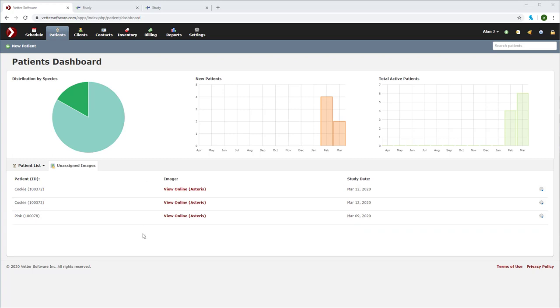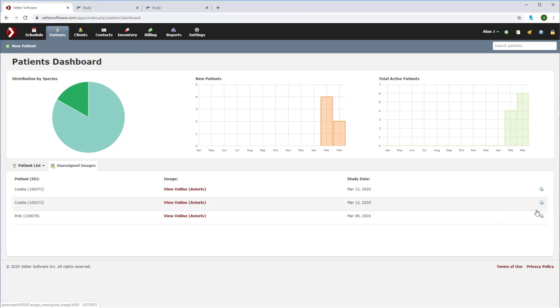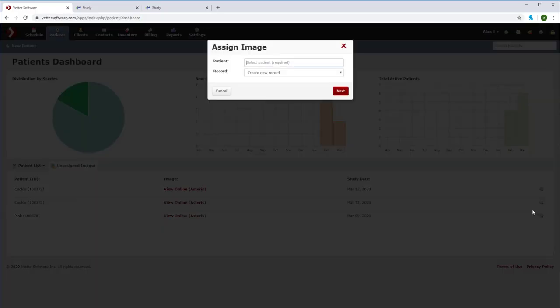In this case, we'll use cookie. On the far right, select the assign images drop down. Now we can enter the desired patient file and create an appropriate Vetter imaging request.